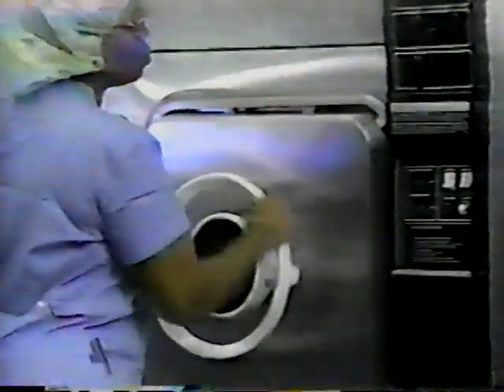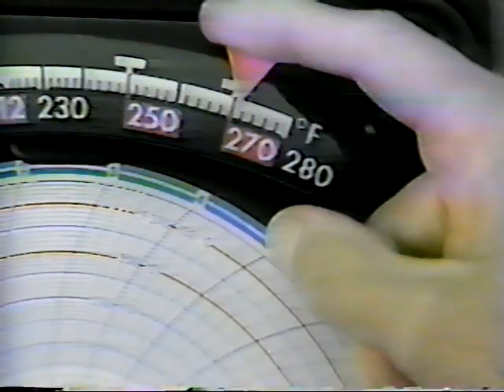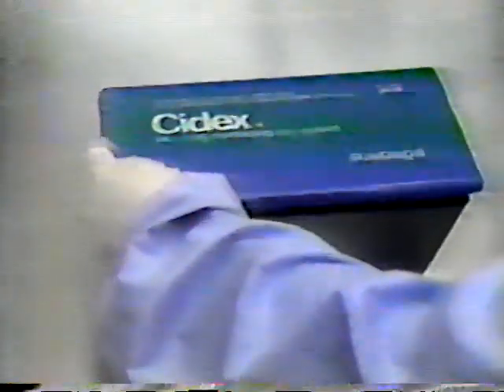Principle number 1. All items used within a sterile field must be sterile. There are many ways to kill microorganisms to provide sterile instruments or supplies. Sterilizing agents include steam, ethylene oxide gas, liquid chemicals, dry heat, and radiation.